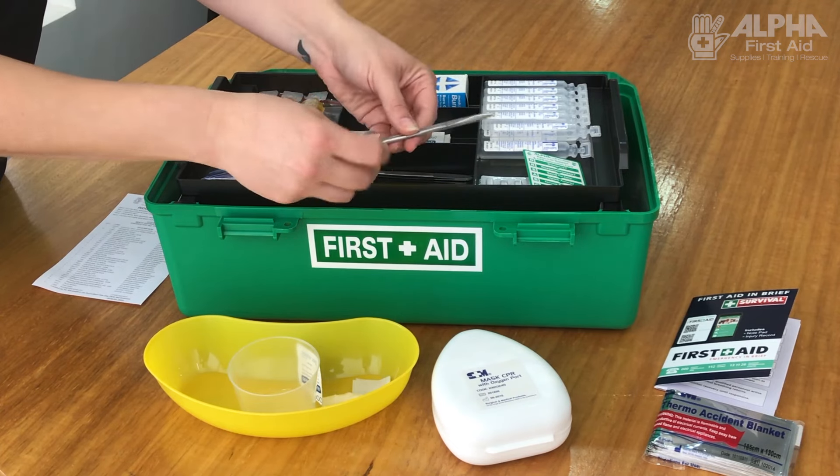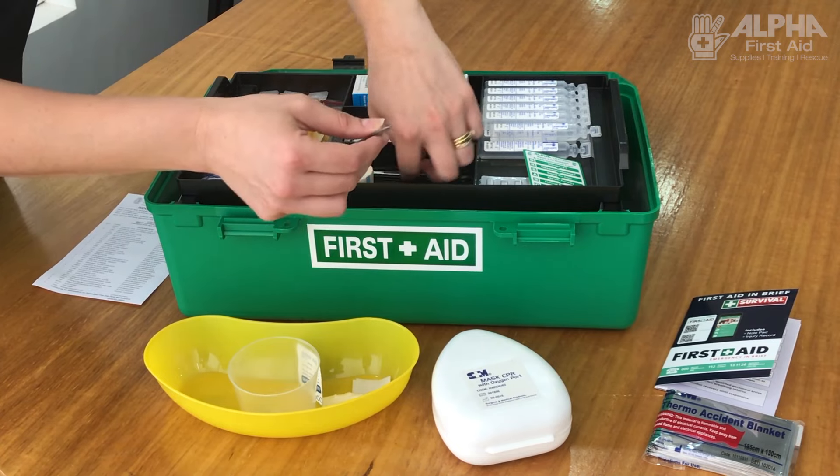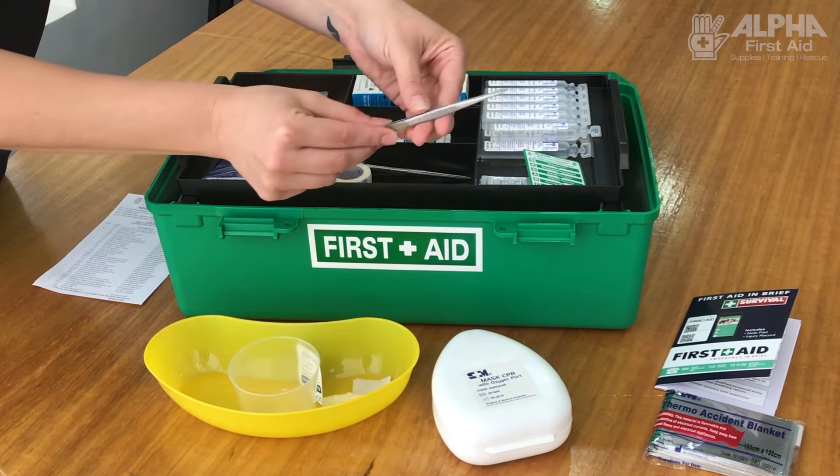Scissors — we know what they're for, but just in case, it's to cut dressings and to cut bandages. And you have the splinter forceps as well.